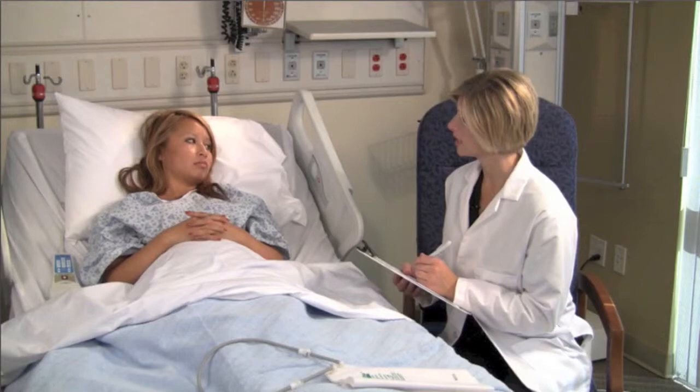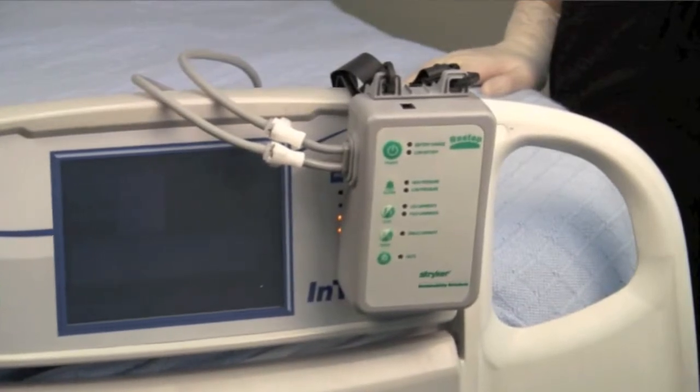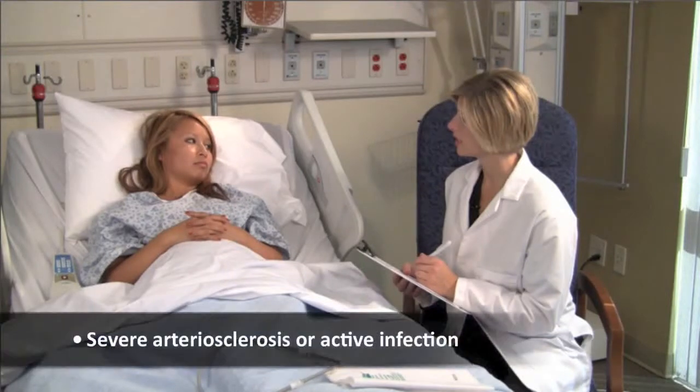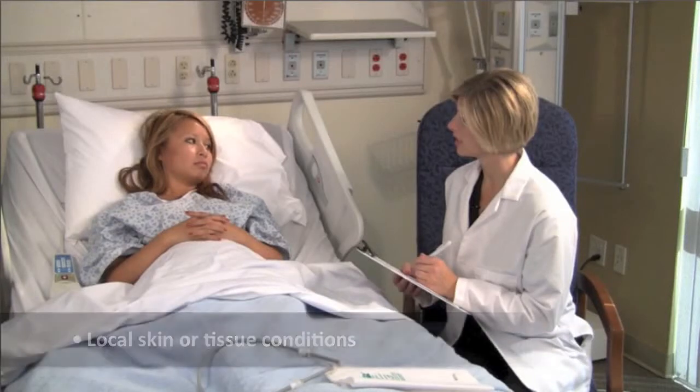Certain medical diagnoses limit the patient's ability to utilize any type of DVT compression systems. This therapy should not be used with patients that have the following diagnosis or condition: severe arterial sclerosis or active infection, suspected or known DVT, severe congestive heart failure or any condition where increased fluid to the heart may be detrimental, existing pulmonary edema, or local skin or tissue conditions in which garments would interfere.